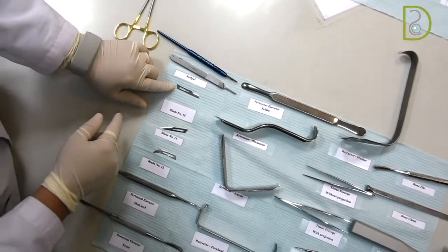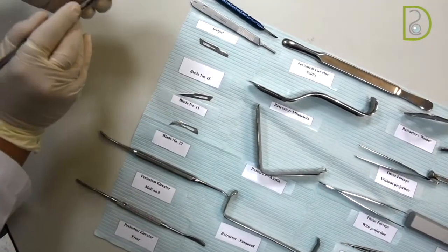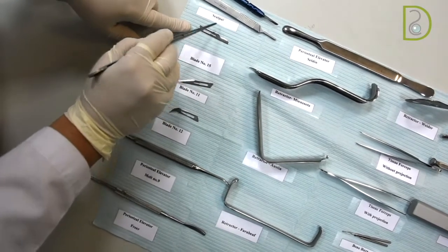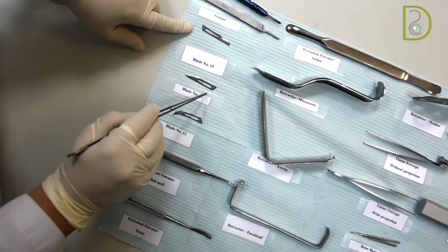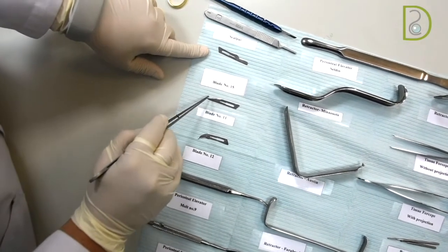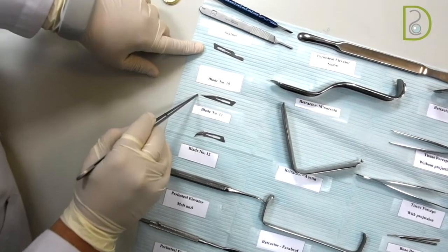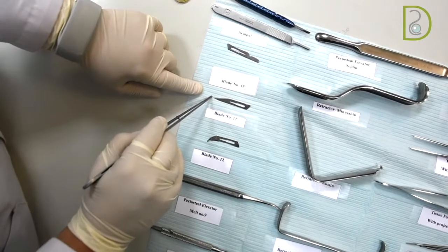Coming now, this is, as we have said, blade number 15. And it is for different incision making in oral surgery. There is a unique design. We call it the blade number 11. It looks like a number one with its sharp and pointy edge, mainly for abscess drainage.